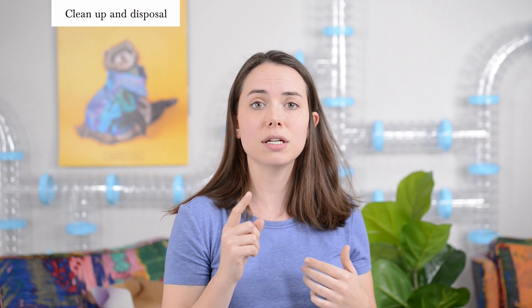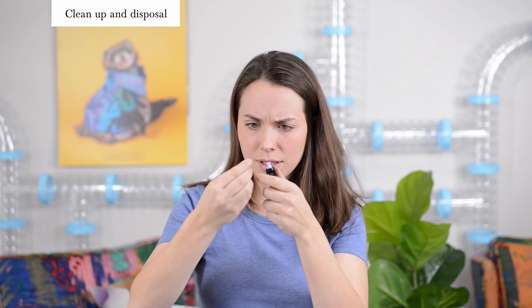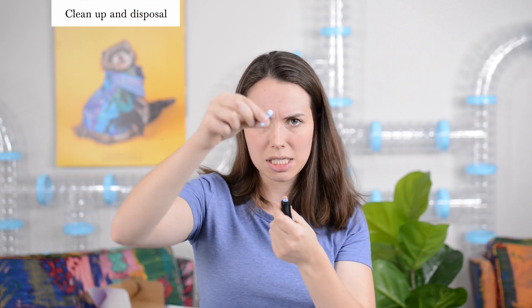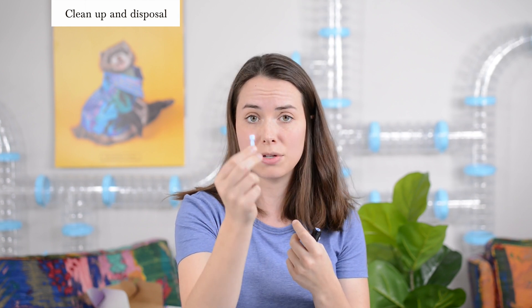After recording the result, dispose of the dirty test strip — just throw it out. For the needle, replace the cap back on before removing it from the lancing device so you don't poke yourself. Put the top back on the lancing device, then pull out the capped needle. Now the needle is concealed and you can safely throw it out. Make sure to discard both the dirty test strip and the dirty needle — it is a one-time use needle.